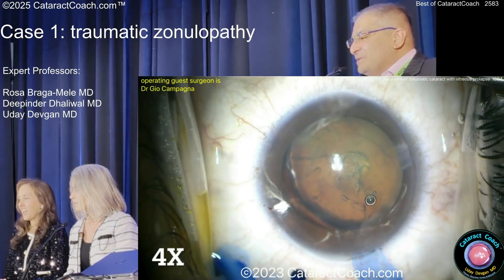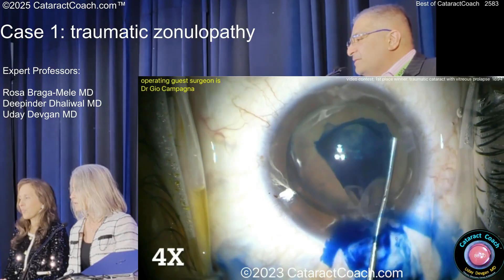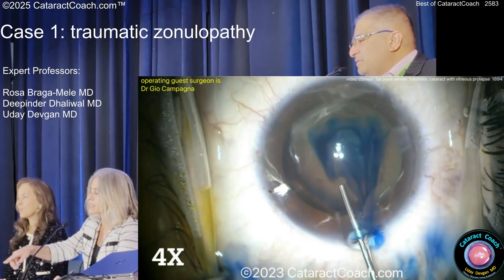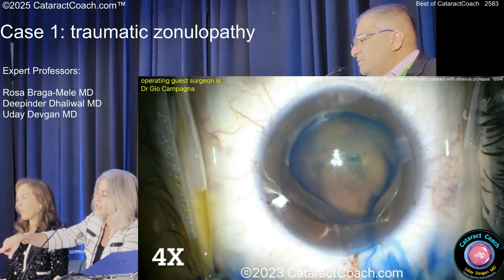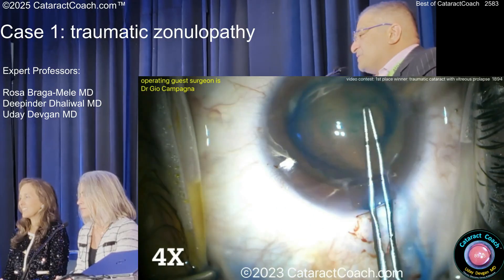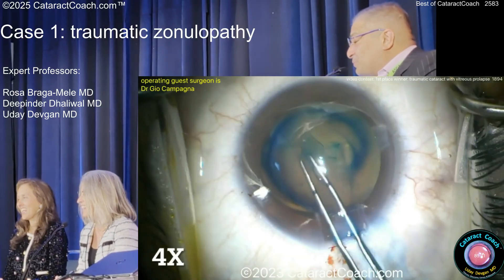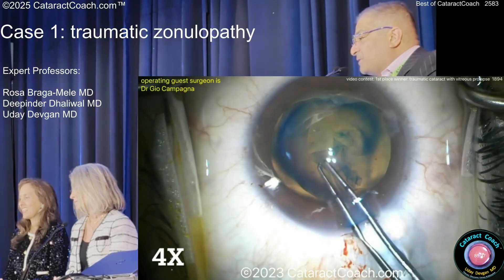Now, this is the important thing — how do you guys inject the trypan blue? I do it under viscoelastic and I paint it, because if you inject it under air, it will go under all that zonular dialysis and you will have no red reflex for your case. That is such an important point. If you just inject the trypan blue, it goes into the vitreous cavity and then you will not have a red reflex throughout the case.